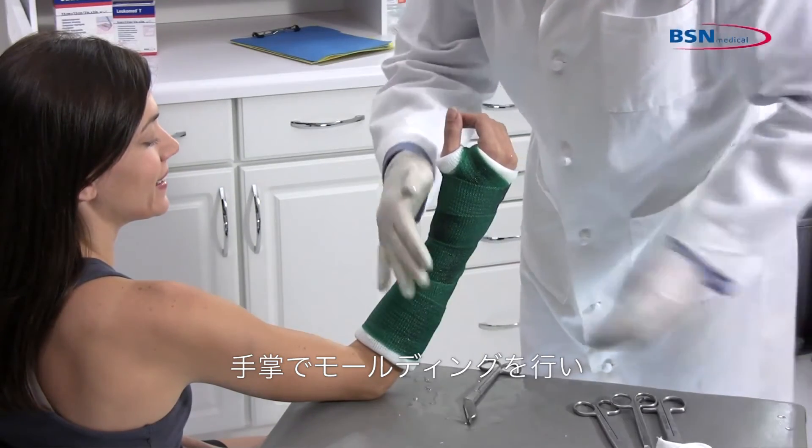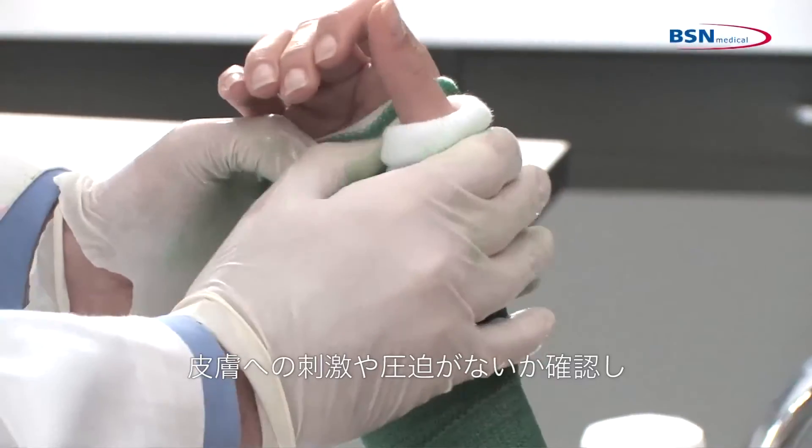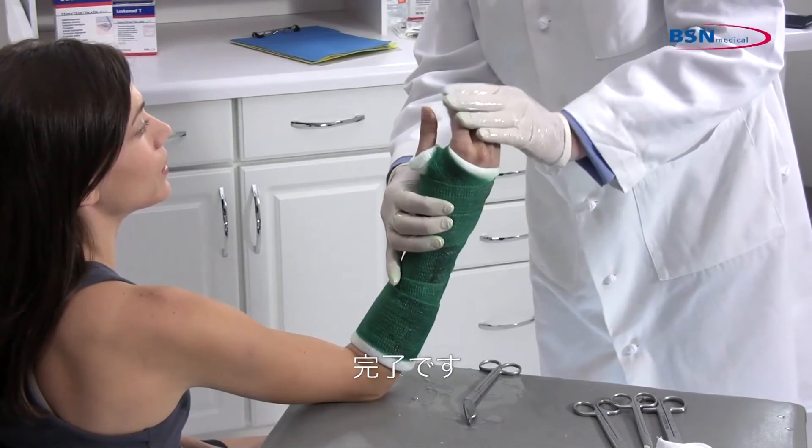Mold the cast with the palm of your hands and check for any limitations in range of motion. Check for any pressure points that may cause irritation. And you are finished.